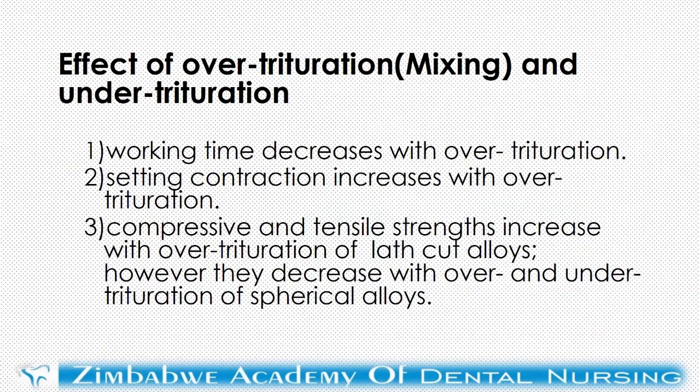So the machine comes with a timer. You need to put the correct time or plug in the correct time, because there are problems of over-mixing. There are also problems to do with under-mixing or trituration. If you over-mix or over-triturate, you reduce the working time. It means the amalgam starts getting hard before you hand it over to the dental therapist or the dentist.